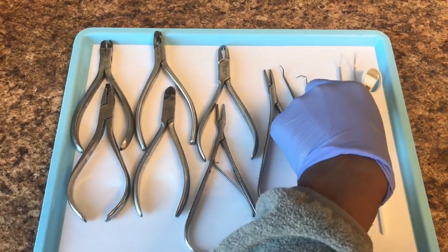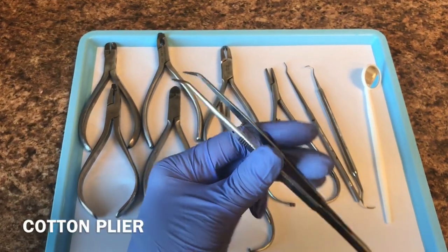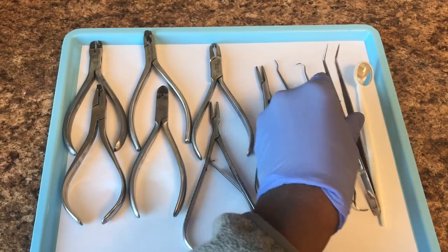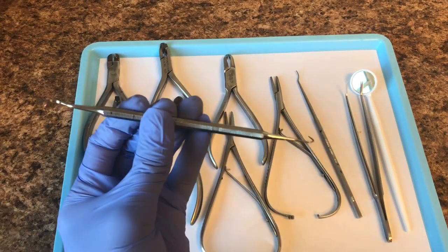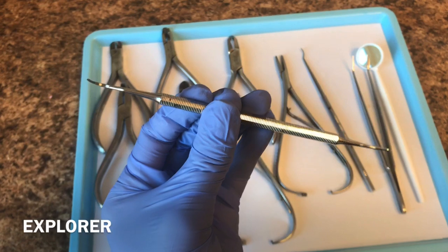We have a cotton plier here, which is used to take up items from the drawer instead of using your hands so everything stays sterile. Next, we have an explorer. This explorer we use to take off colors from each bracket.